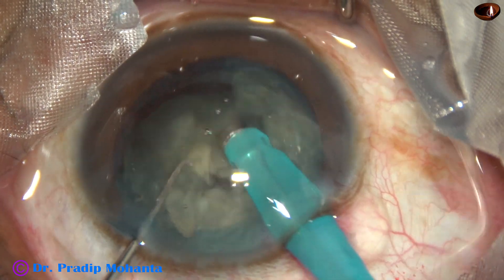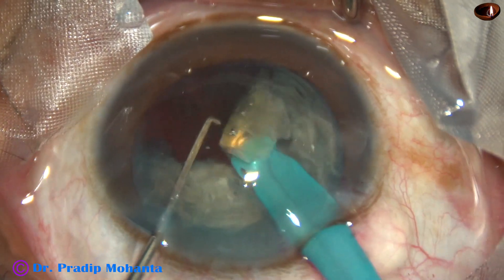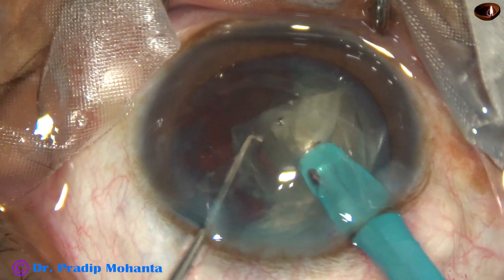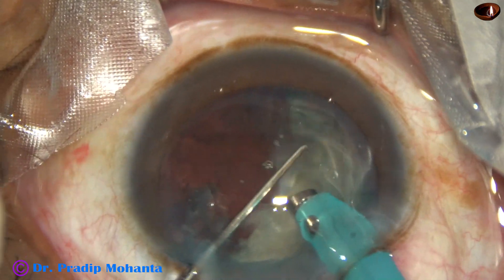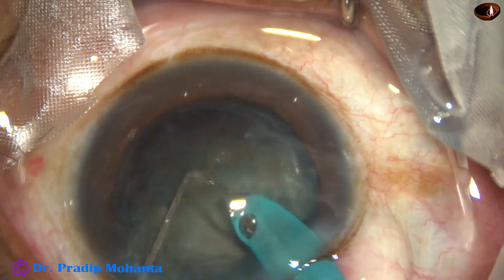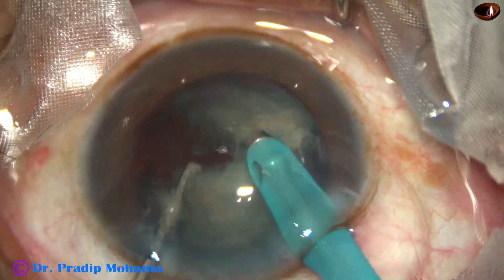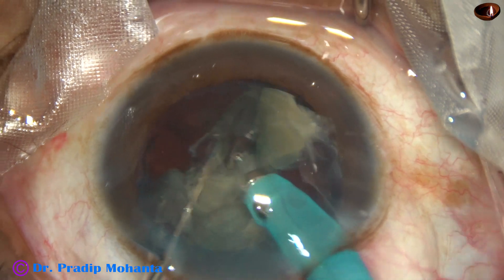The chopper being used has been modified from a Sinskey hook — just a little stouter and thicker than a Sinskey hook — and it has been designed by me. I am very comfortable with this small chopper.